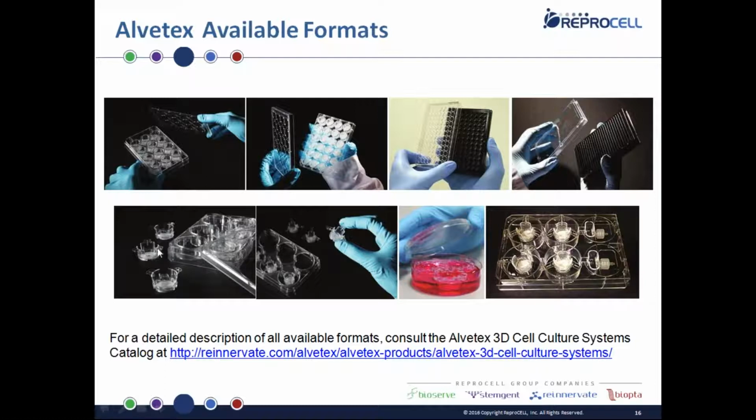Yes, you might be able here to see that you've got little windows which have been cut in the wall of the insert. This is to allow the medium to float in, so the cells are well fed from the top, but also because the insert is suspended in the well, they are being fed from underneath. So they're getting a maximum amount of nutrition, and this is going to help in terms of growth.